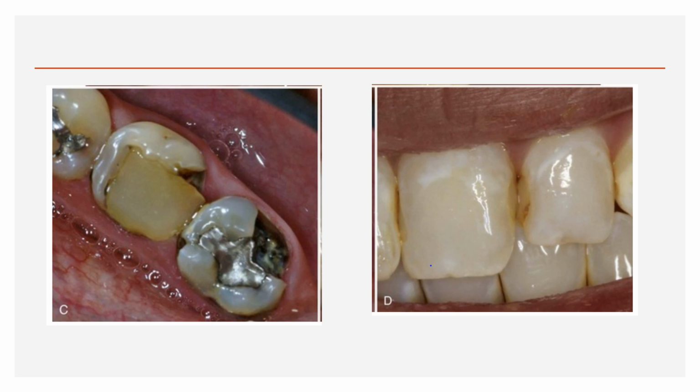So how to identify? With the help of a radiograph you can clearly see the secondary caries in the first picture, and by running the probe you can feel the soft debris, and there is definitely leakage of the restoration. Definitely you need a re-restoration for the first picture. In the second one, aesthetically it is not good, and it's an anterior tooth, so nobody likes it that way.